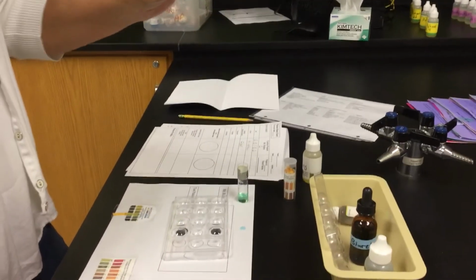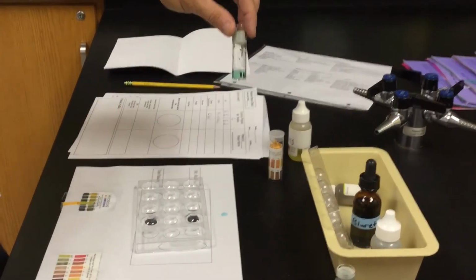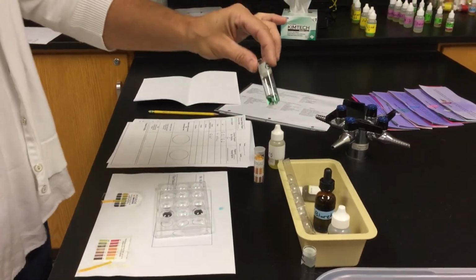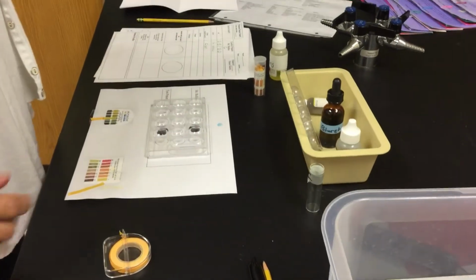So you'll see on your data chart, if you have 0 sugar, it's going to stay the same bluish color, so we would say it would be negative. If it changes to slightly green, we'll say +1, a little bit of sugar getting passed in the urine. If it's maybe a darker green, maybe +2. If it's red or orange, it's +3, and we have a lot of sugar within that. So this would actually go off. There's a heat bath underneath the chemical hood over there. I'm going to put it off to the side right now. We have one in there, so we'll come back to that. That has to sit 3 to 5 minutes.